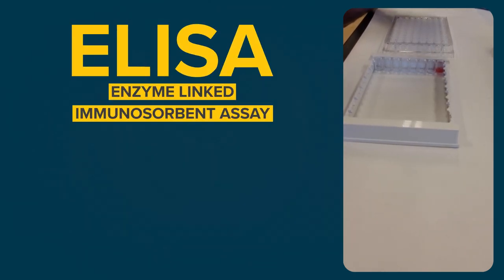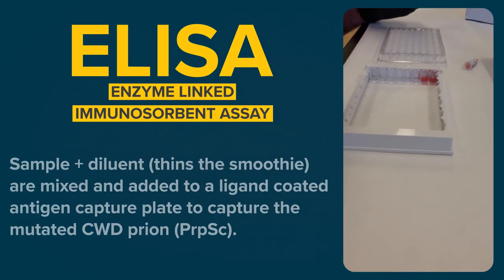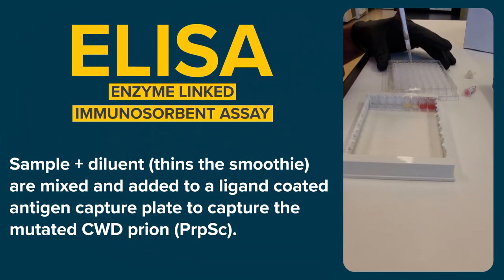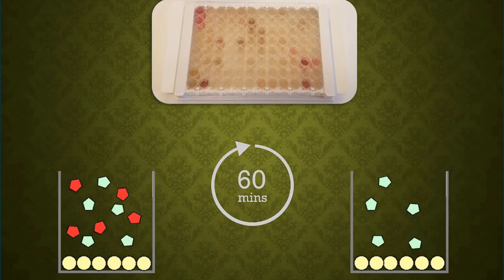To test the sample for CWD, we use ELISA, or the enzyme-linked immunosorbent assay. A diluent is mixed with the sample to thin it, and then we add a mixture to a ligand-coated antigen capture plate to capture the mutated CWD prion. We add negative and positive controls to every plate. The sample incubates for 60 minutes, and if the mutated CWD prion is present, it binds to the ligand on the plate.